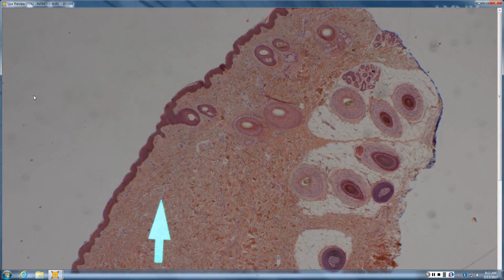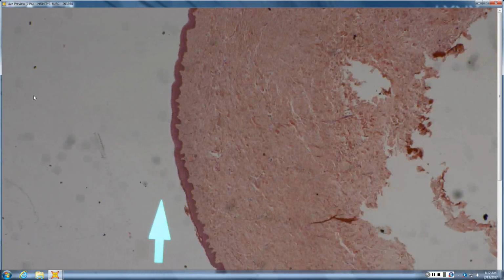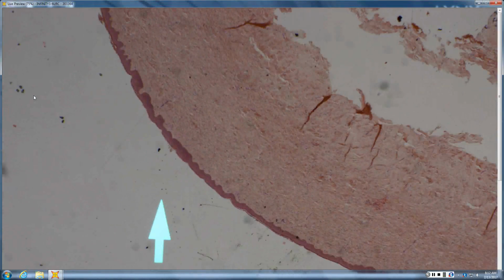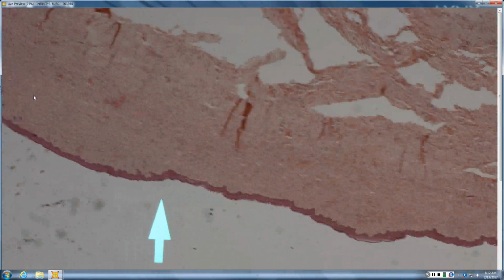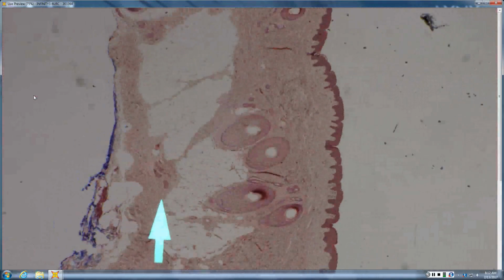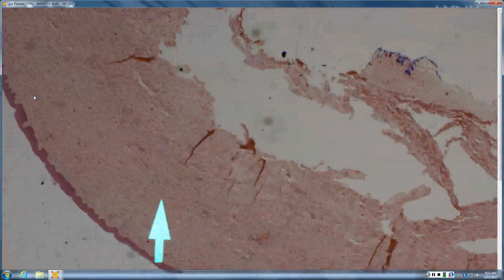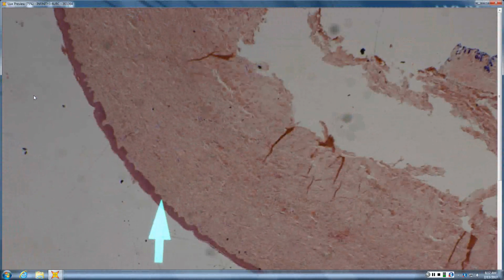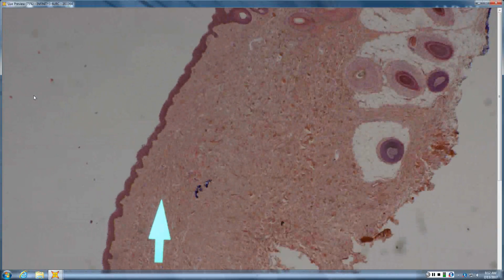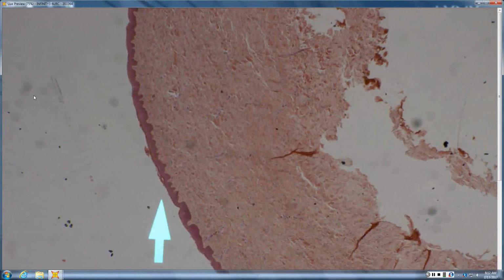Maybe on the scalp? Maybe on the scalp, and then what's wrong with the scalp? Oh, there are hair follicles in this portion. Yeah, there's a big broad zone with no hair follicles, and then you get to the other side and there are hair follicles again. So what would give you a big, broad, hairless patch on a scalp, and the collagen's pretty small and red, so it's probably a kid. Like an early nevus sebaceous?